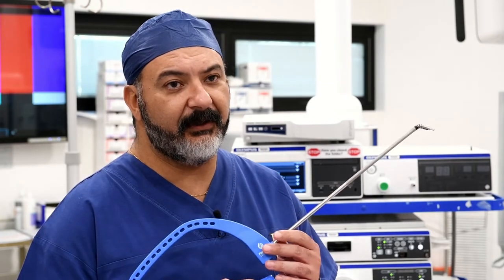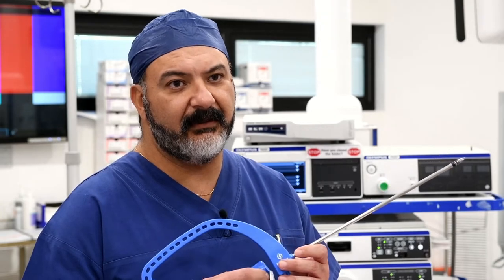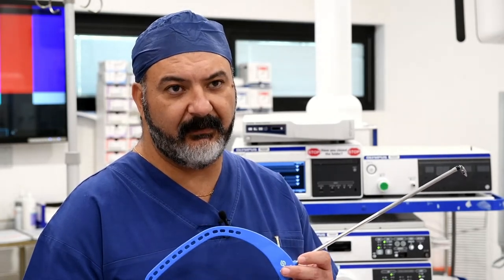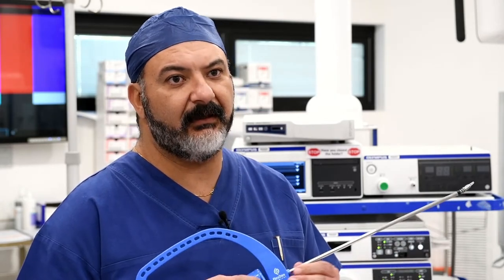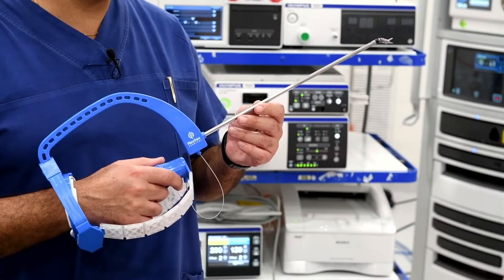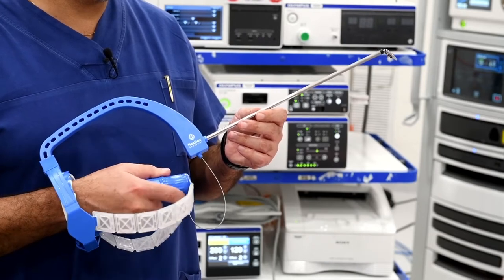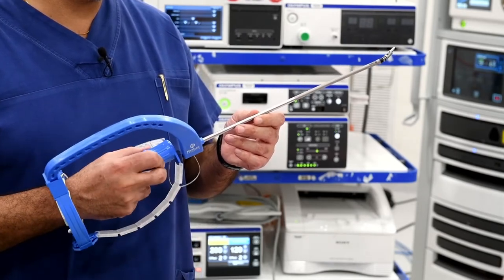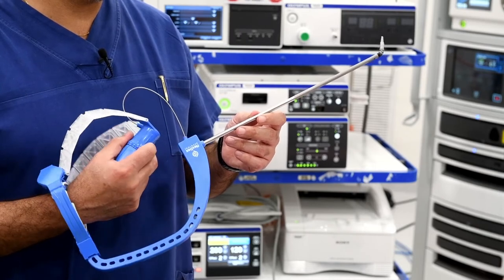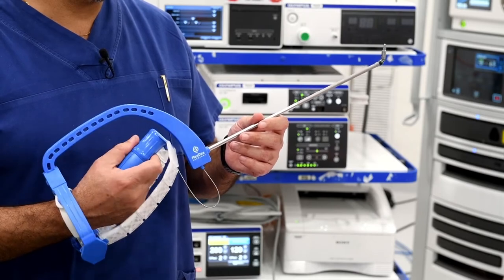I like the idea of the FlexDex because it is an intuitive wrist instrument that allows much more flexibility when I do laparoscopic surgery than using a straight stick instrument. The wristing is very intuitive, the movement is very intuitive, and really once you get used to how it moves it becomes second nature and you don't have to think about how to move the instrument to achieve the action that you want.